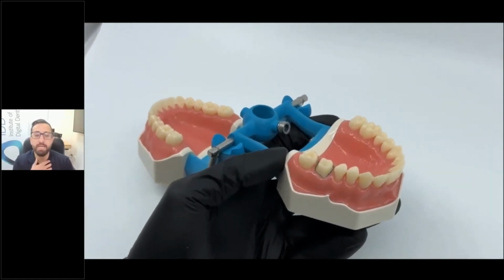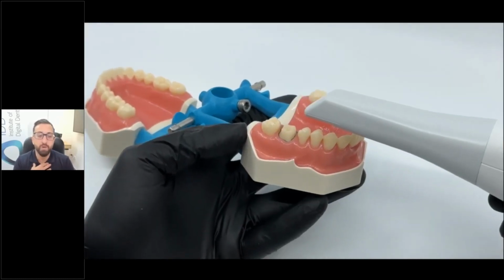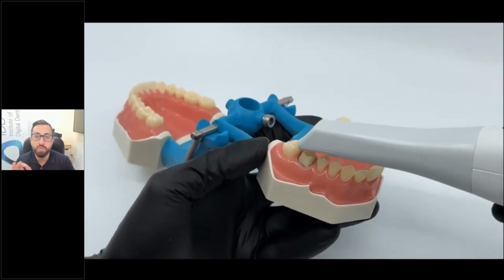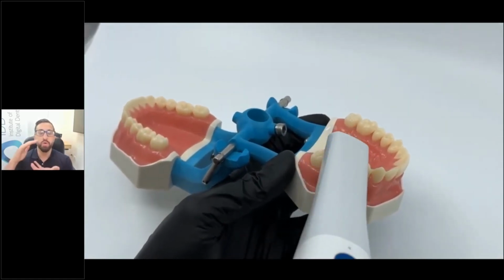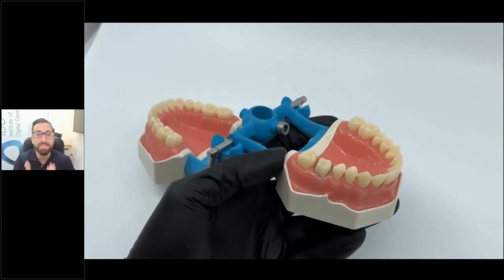I'll just play this again. You do your occlusal scan, you rotate, do your palatal scan, rotate, get your buccal scan, and notice how I go back and I tilt the scanner to get these interproximal contact areas. You can also approach it from the buccal, as I showed you, because in a patient's mouth, you can't always lift the scanner up like that, because obviously their mandible is in the way or their maxilla is in the way. So oftentimes I go 90 degrees basically from the side of the cheek, and I rotate that way.